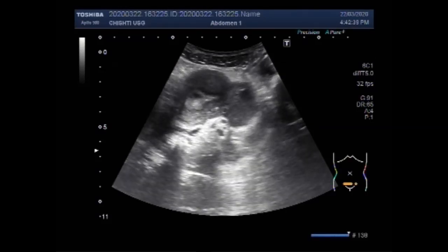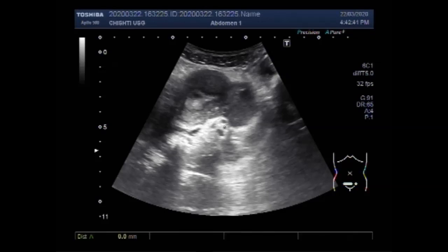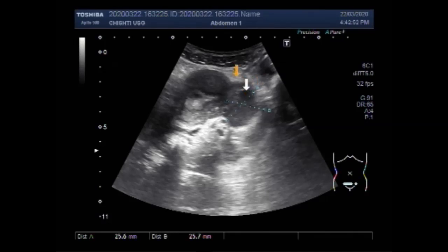This is possibly the better image to get the size of this cyst, and it measures 2.6 x 2.6 cm.